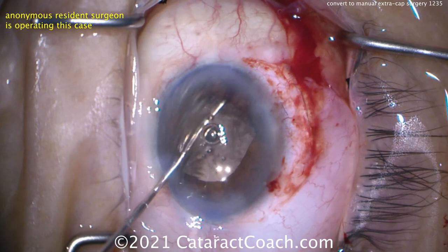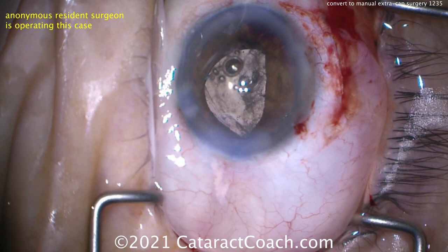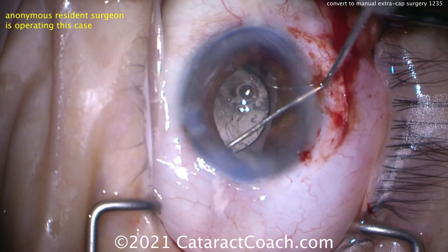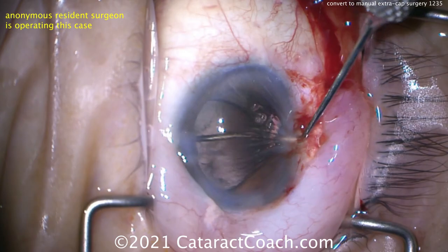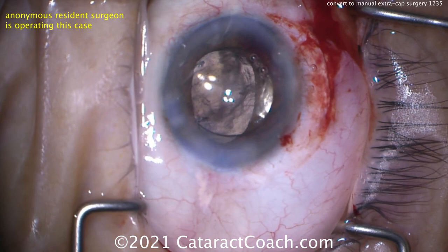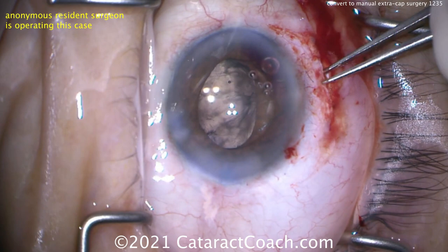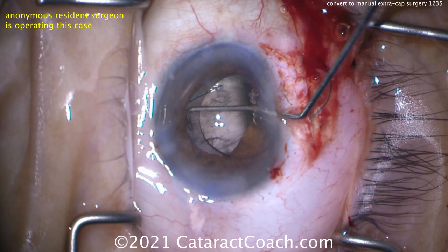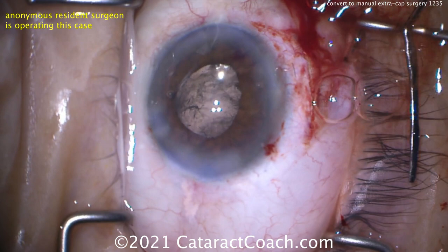Here's the three-piece lens going in correctly in the anti-S orientation, carefully dialed into the sulcus. There's one haptic in — now get the other haptic going in. You have to be able to do this to salvage your case. The trailing haptic is being dialed in. Rotating a little more. You can see the instruction being given so the resident learns. Both haptics must be above the anterior lens capsule. Spending the time to manipulate and get that trailing haptic in the right position. That looks much better — happy with the support.